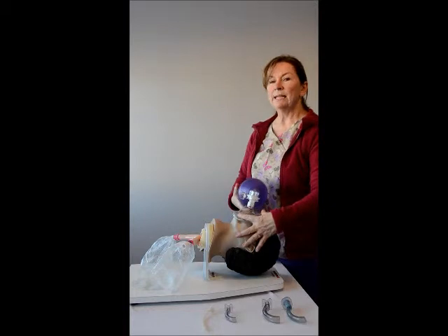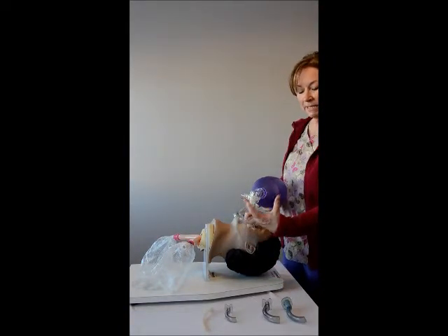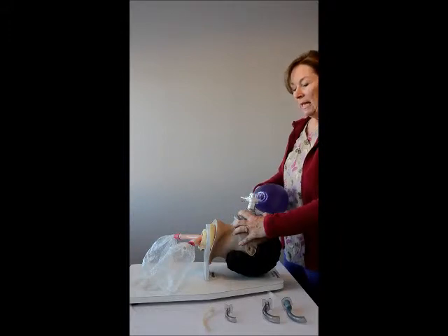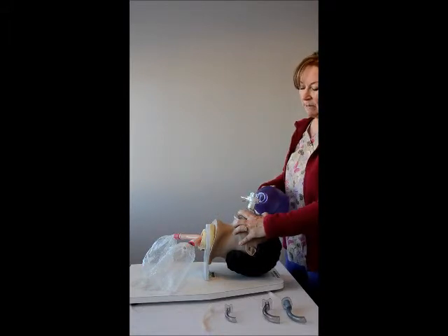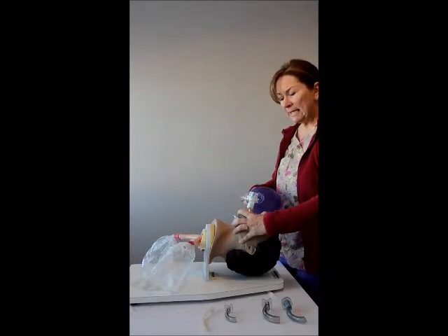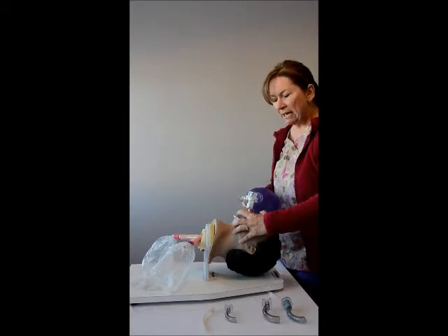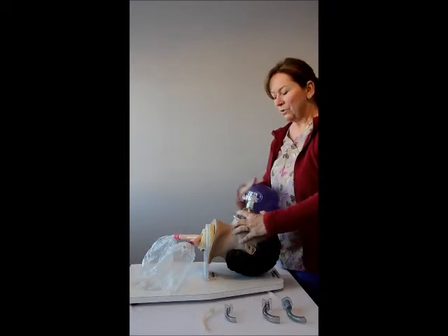In practice, some people have issues handling the Ambu bag correctly. There are two techniques. The first is called the C technique: take your index finger and thumb placed down on the mask, with the three remaining fingers underneath the jaw to help ensure a seal. I then deliver breathing, confirm chest rise, and breathe for my patient in respiratory arrest every five to six seconds — that's 10 to 12 breaths per minute.